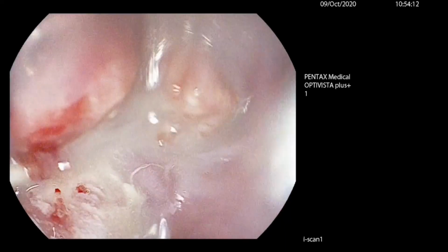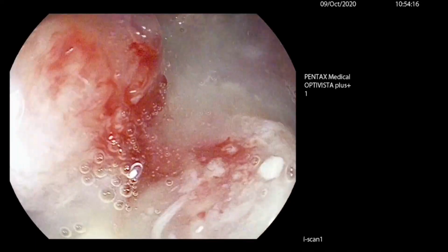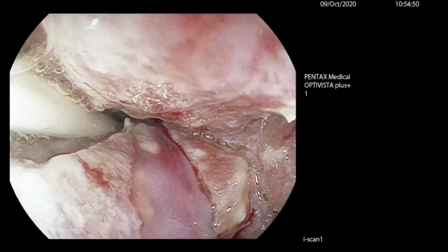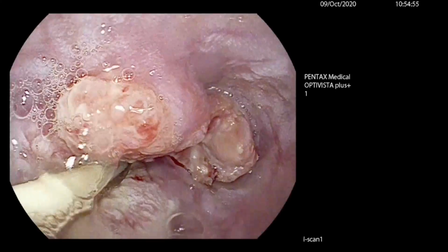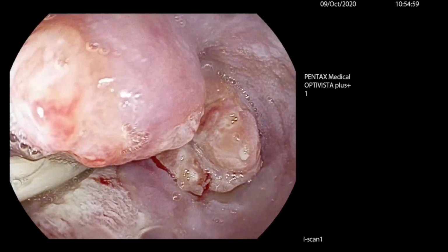You can also ask your nursing staff to raise the head of the patient's bed here to get gravity on your side. Once you have aspirated the fluid, it becomes very clear that it will be impossible to pass this tumour with a gastroscope, and therefore I will do an on-table barium study to delineate the nature and length of the stricture.